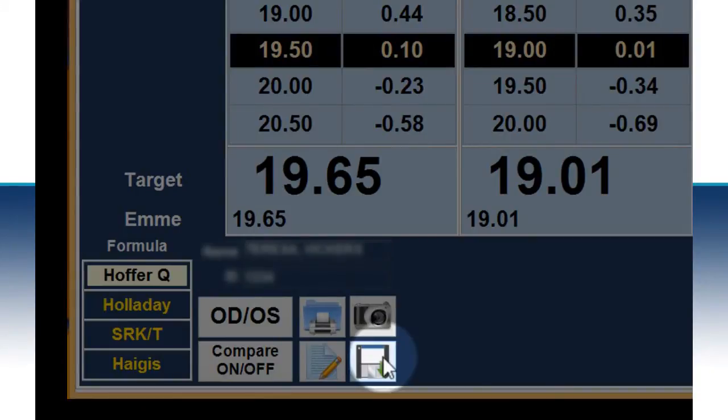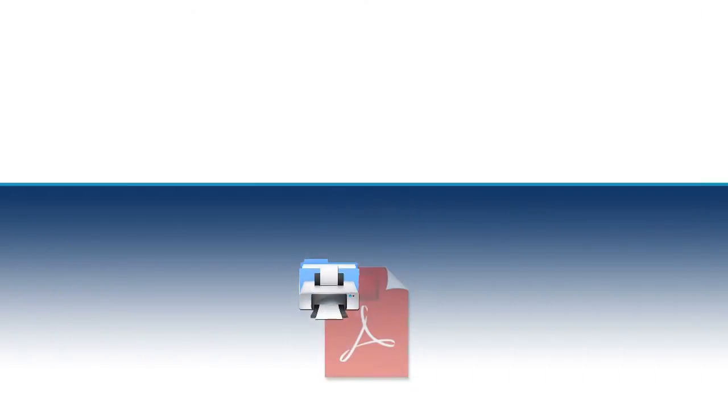If you do not click the save icon, you will lose your data. If desired, select the print icon to generate a PDF or send to a local printer.